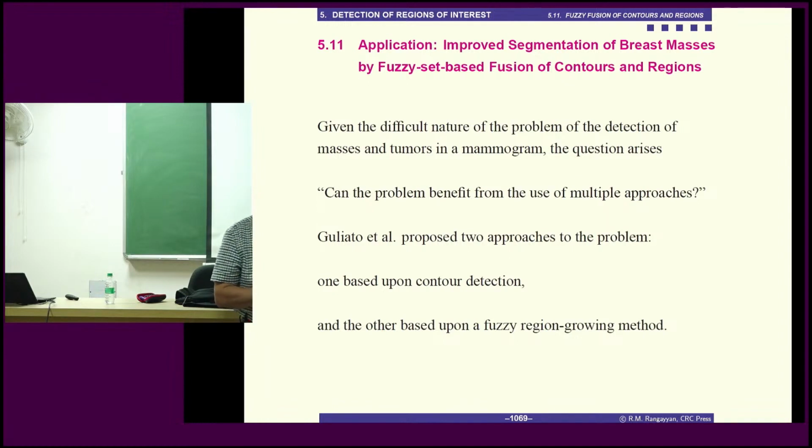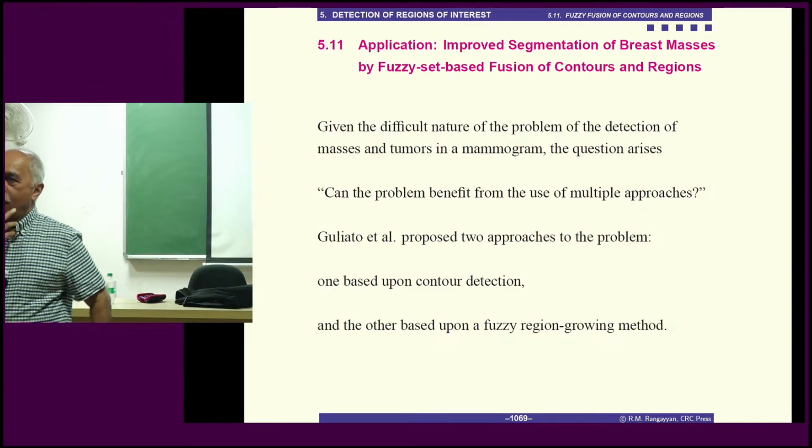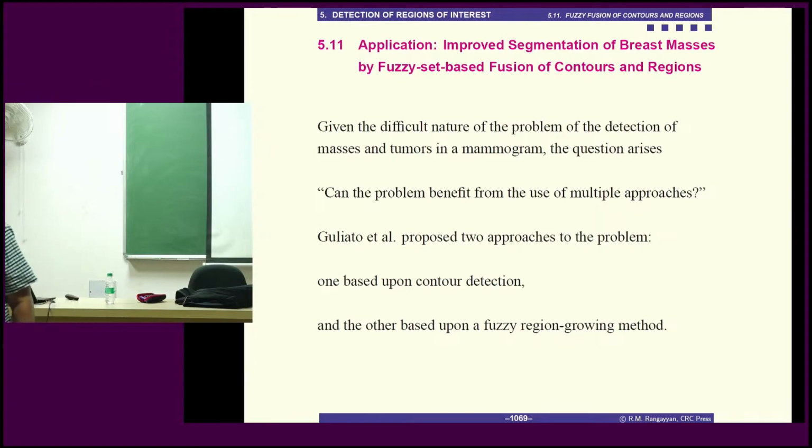Is there any use of using multiple filters on the same image? Multiple filters, like different filters on the same image. Can we use it? We have used multiple Gabor filters with different orientation and scale here. But those are the same filter with just the parameters changed. I'm asking about Gabor filter or Hough transform together with other filters. Is there any problem or advantage in using that?